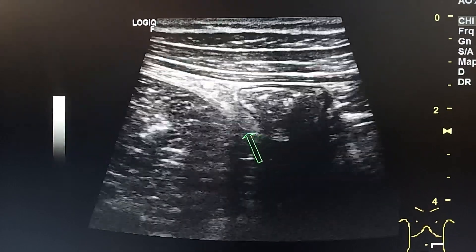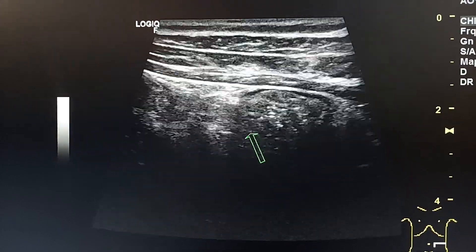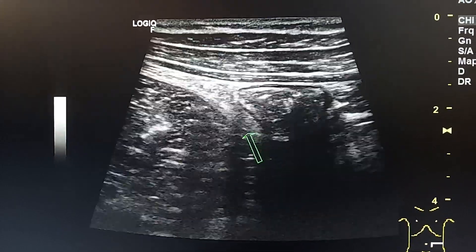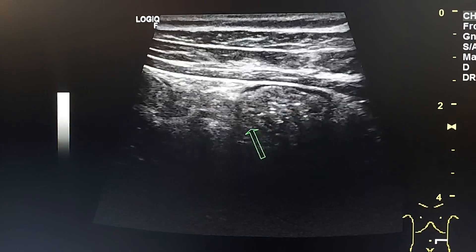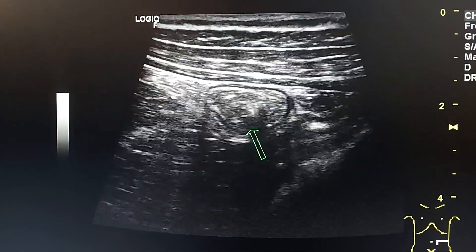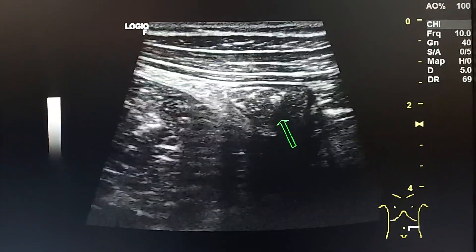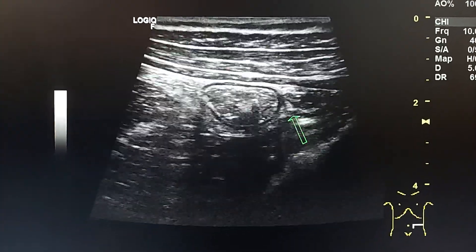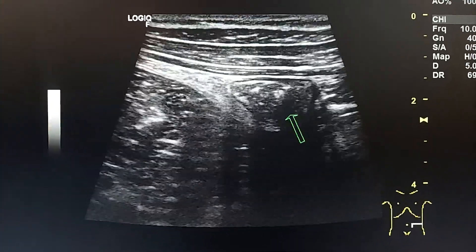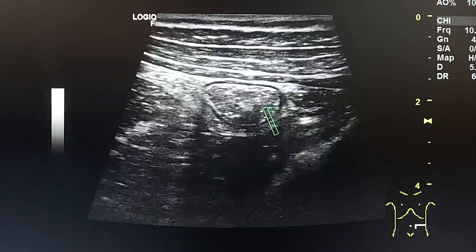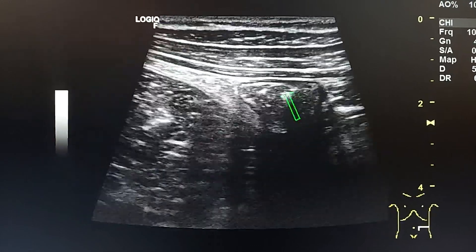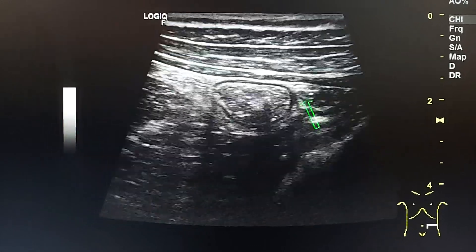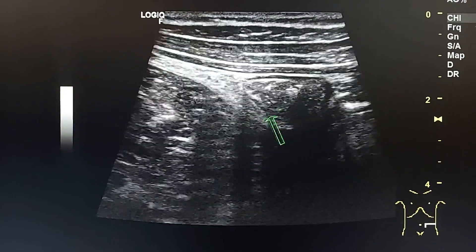This is how to identify the descending colon by a linear probe. This is a transverse section in the left iliac fossa. Here we see the descending colon.